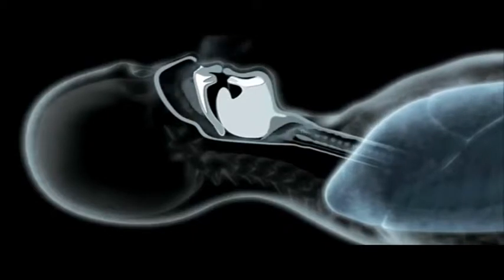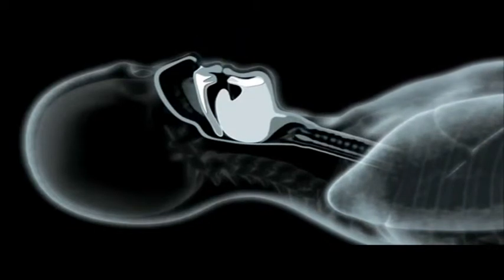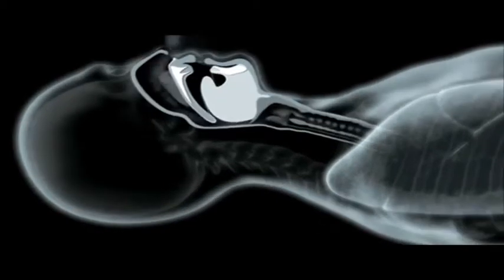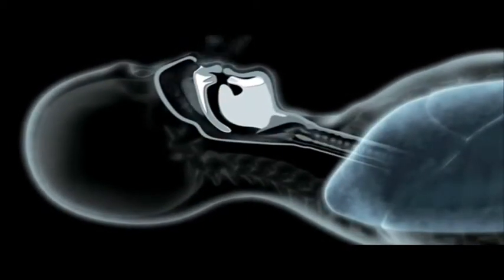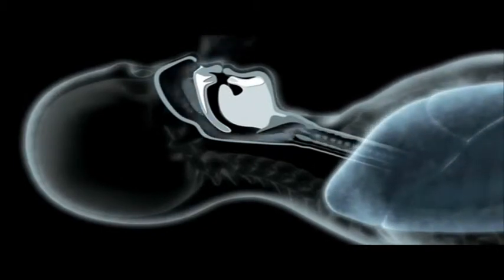An obstructive apnea occurs when the upper airway becomes very obstructed or completely closed. With no respiratory flow, blood oxygen levels drop. The patient must arouse and restore the upper airway tone to begin breathing normally again.